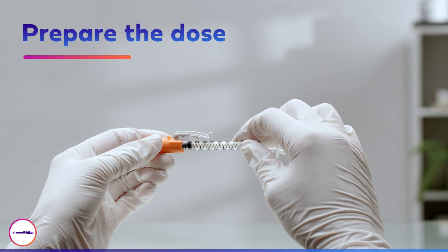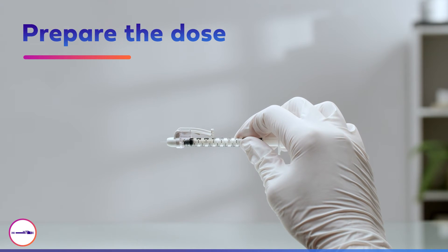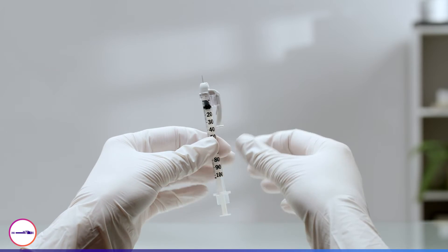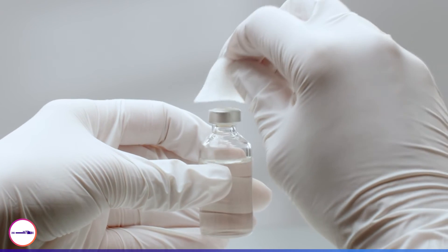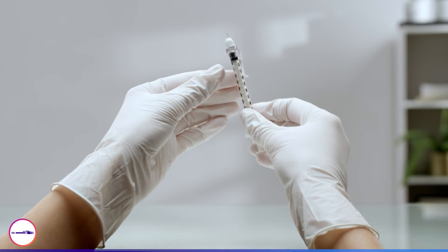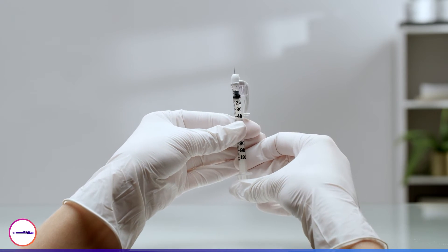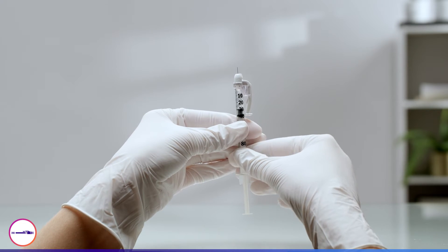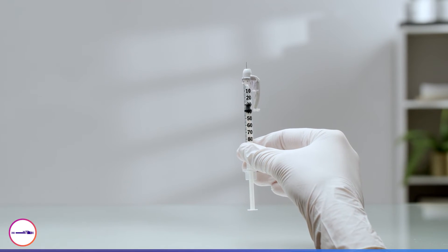Start by removing the orange safety shield. Rotate the safety arm to make sure the unit scale is visible. Next, wipe the vial with an alcohol swab. Pull the insulin syringe plunger down to the desired number of units. You will need air in the syringe equal to the amount of insulin you will take out.